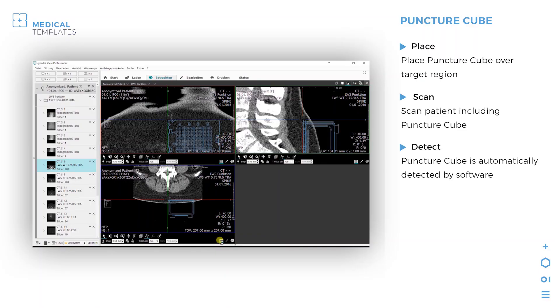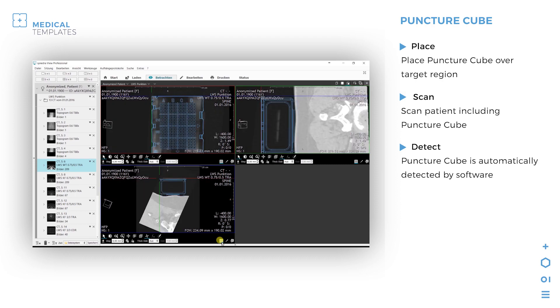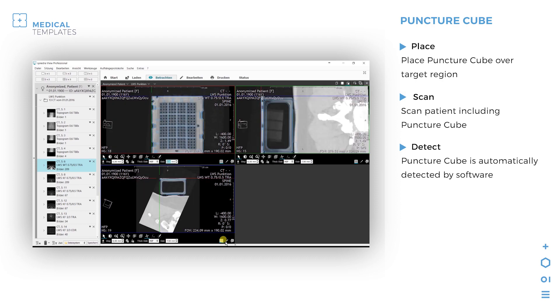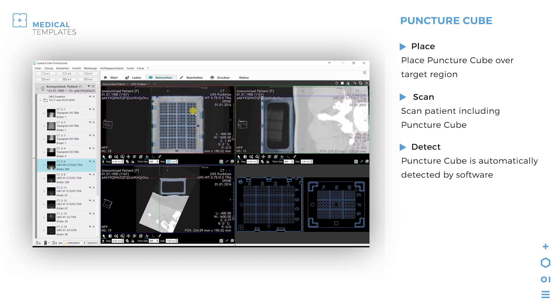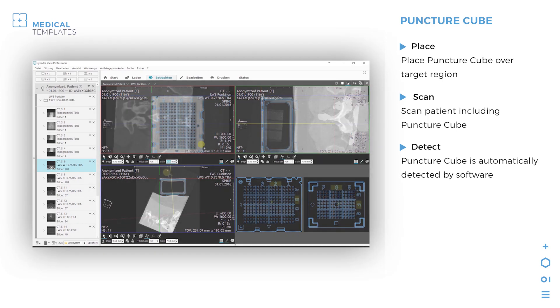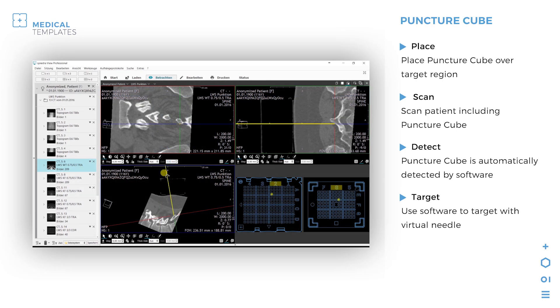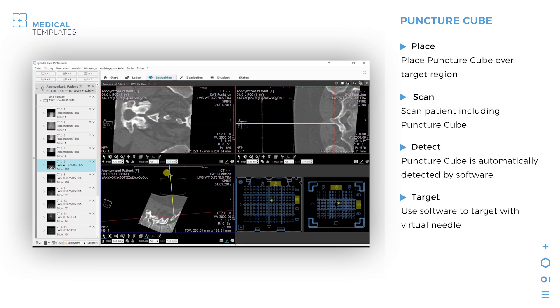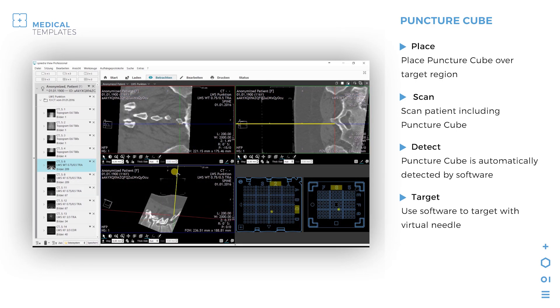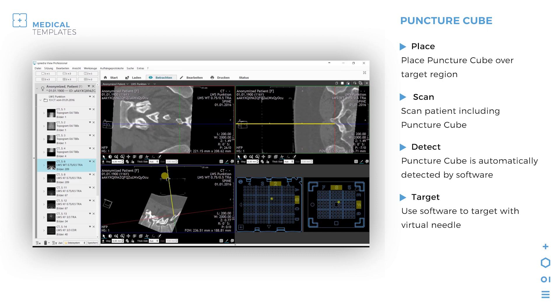Step 3: The scanned cube is automatically detected by the software. Step 4: Use the software to plan the intervention with the virtual needle.